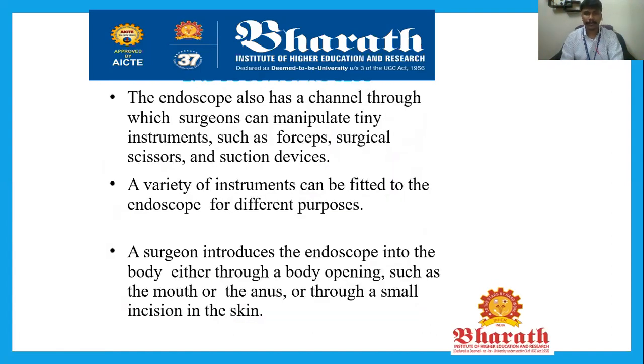Endoscope also has a channel through which the surgeon can manipulate tiny instruments such as forceps, surgical scissors, and suction devices. That means the endoscope has a separate channel where people can proceed with the surgical instrument. Nowadays, by using the endoscope component, people are doing surgery with the help of endoscopy.